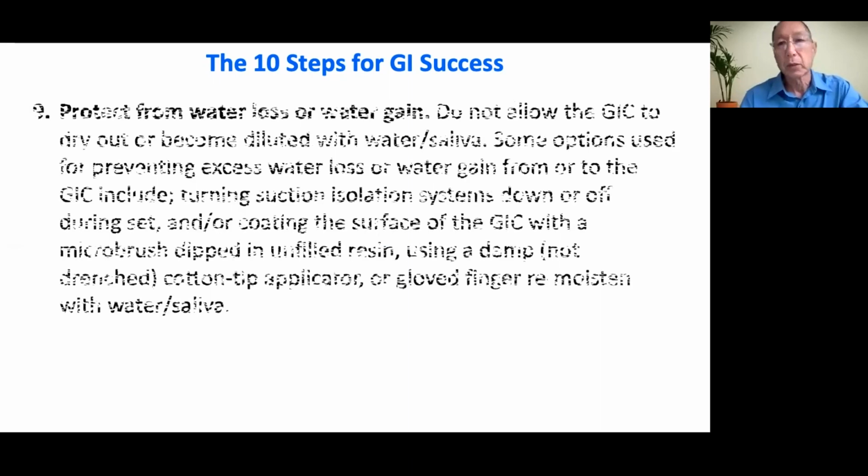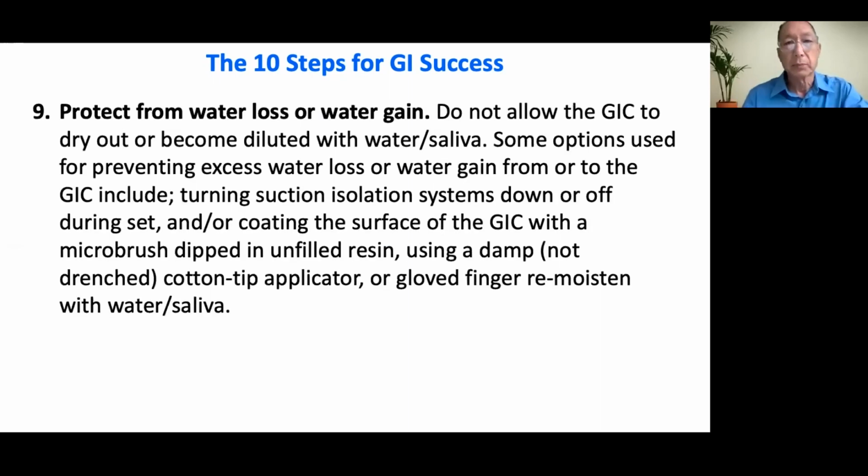Step number 9, protect from water loss or water gain. There's many ways to do it, but one way is to simply watch it, and when it starts to evaporate at the surface because it's turning dull, you can simply wet it again, water or saliva.